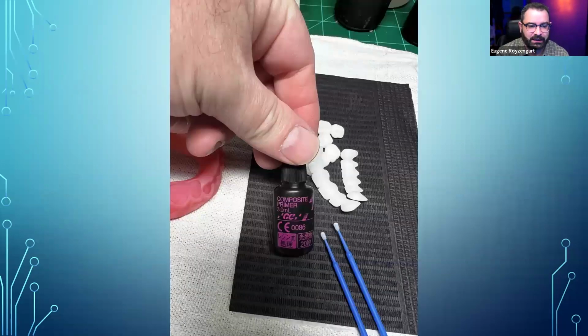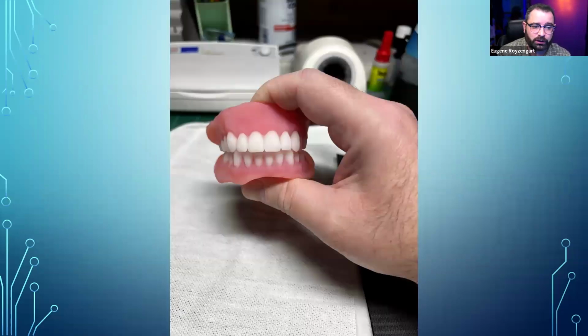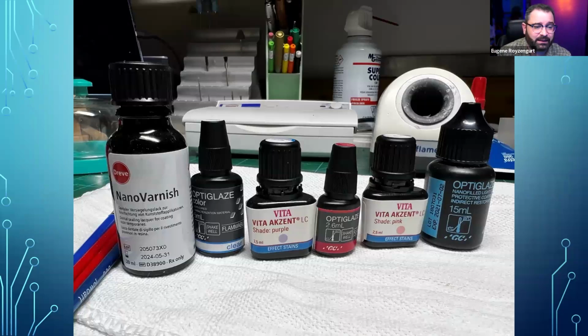So here, basically, I use composite primer to bond stuff together. I'm pretty sure even if you don't use that, it's going to bond well, but I just like to take that extra step. And here I use the glaze to bond stuff together. So it looks really well. And basically, I just want to beautify things up. I use different glazes. Like on the teeth, I'll use the nano varnish because it's really thin. It doesn't mess up your texture. And this Optiglaze Color Clear also does that really well.